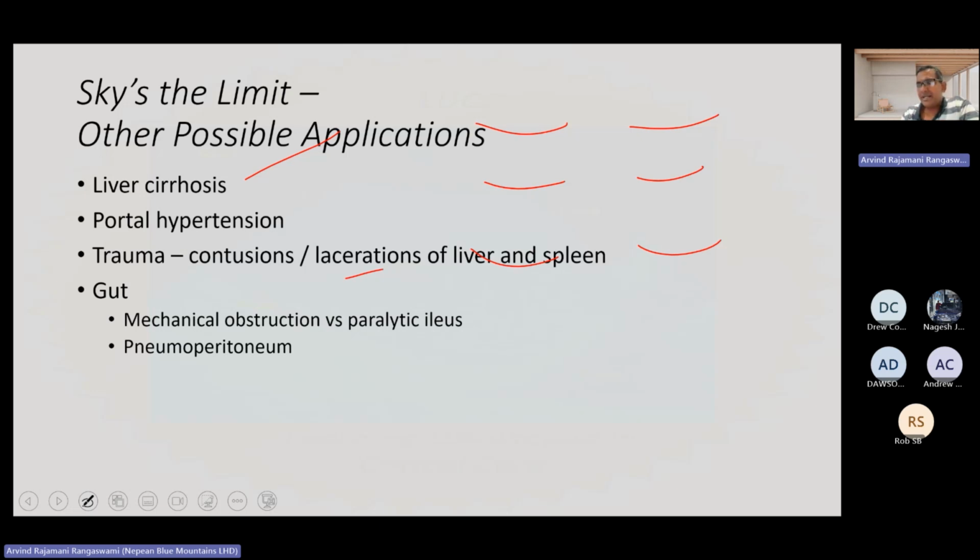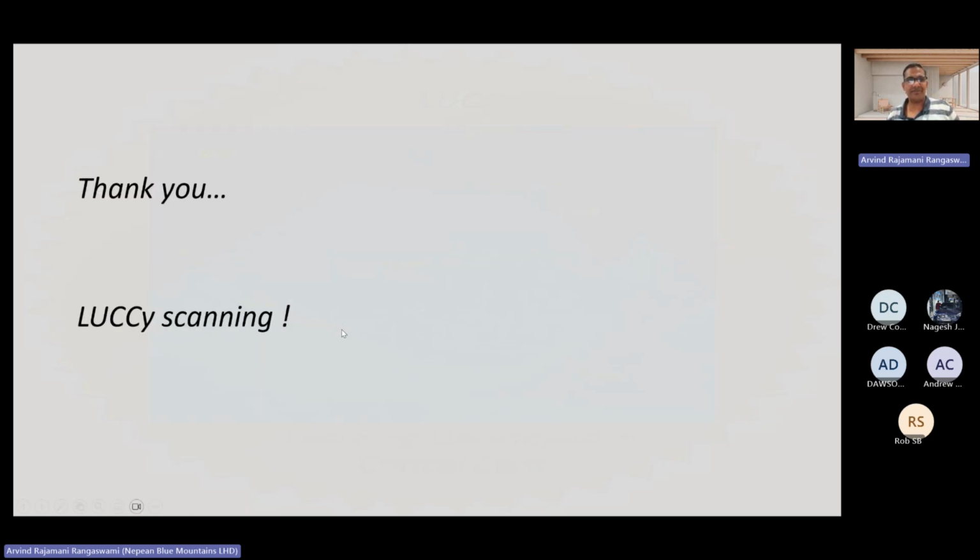There are so many things that you can do with abdominal ultrasound that it's very, very useful. A few months ago, we had a patient where the surgeons were unsure. He came with severe constipation and bowel obstruction. We did an ultrasound and showed very clear pneumoperitoneum in the interval between the initial CT scan and subsequently. I won't say that was the only reason they took him to theater, but I'll probably pat myself on the back for showing them that and convincing them. I'd like to believe that that was one of the reasons.